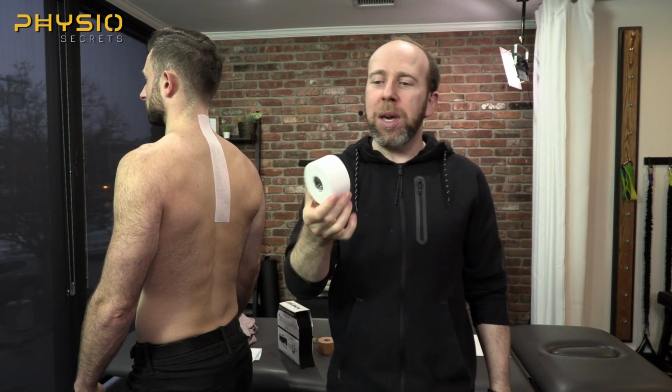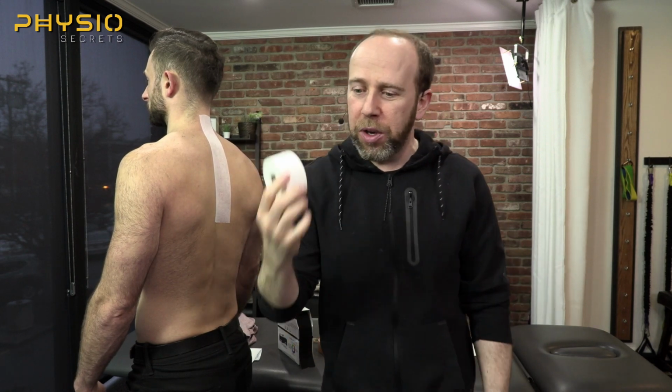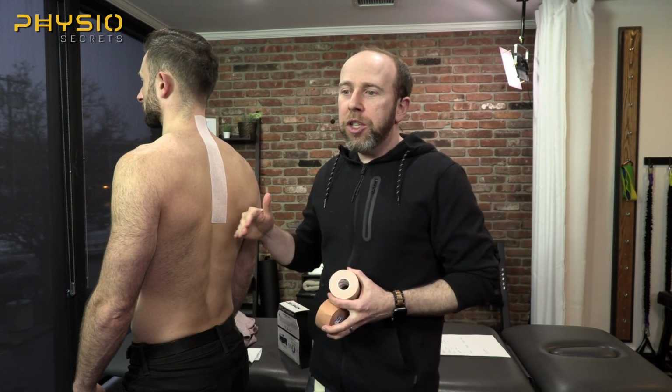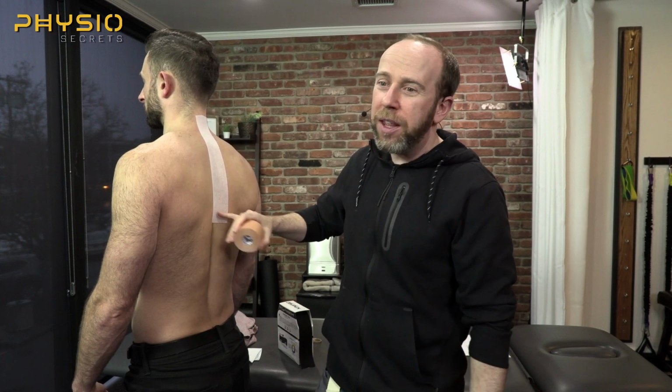If you want to practice taping, get some athletic tape because it's cheap, and you can practice all these tape jobs with the athletic tape until you get good at them, and then go get the expensive stuff. Leuko tape simply reinforces your concepts with your coverall. So if you can get a good coverall application, and I want it to block this so there's no way he's going to move, you just apply the Leuko tape on top of it.